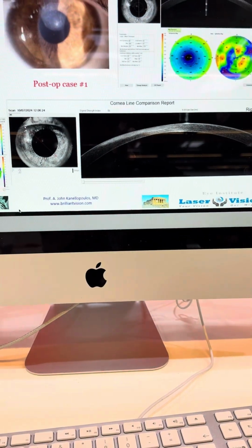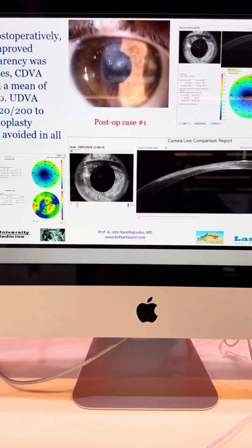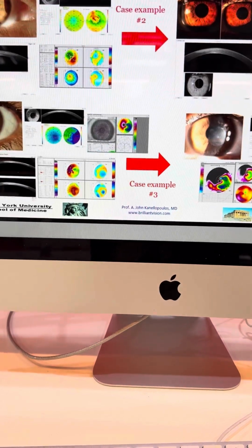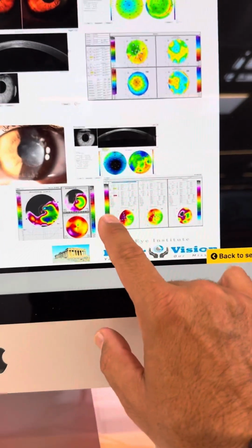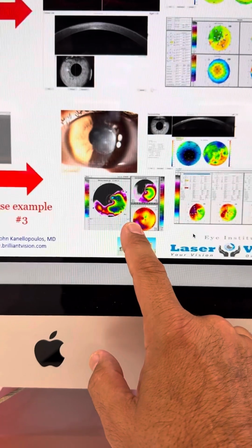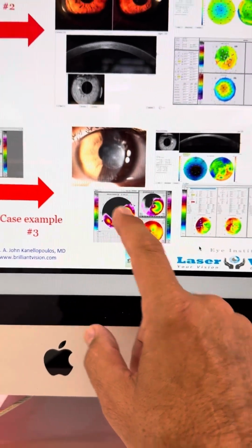This is the outcome on that patient. Afterwards, you can see the scar has become more faint, and the cornea has thinned some, and this is the before and after. But more impressive are the topographies. For instance, here you can see how irregular this cornea is before. It becomes far more regular, a very effective change, and nothing I think underlines the improvement more than this. This is the difference map of before and after on this very dense scar.